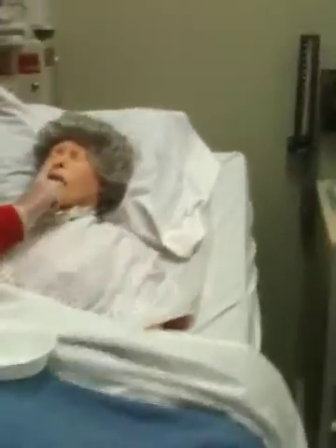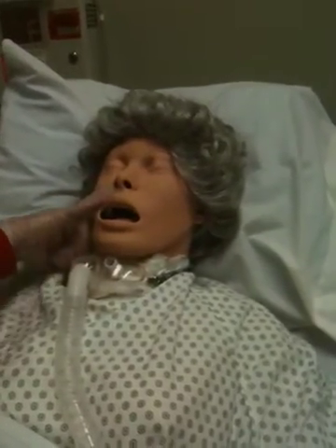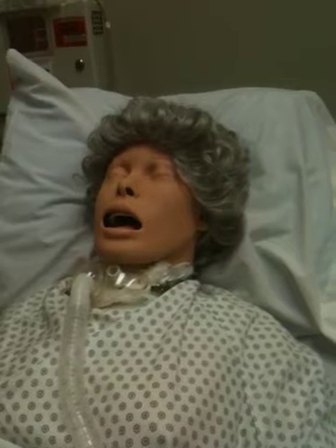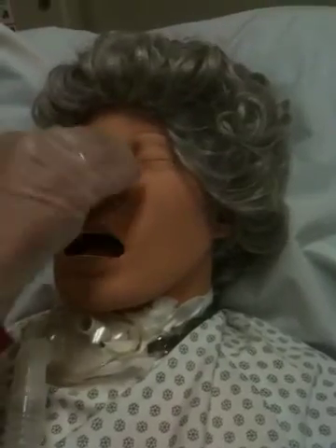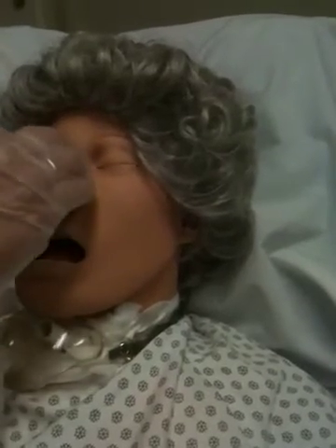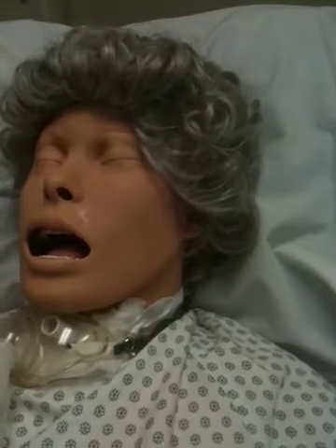I'm going to occlude one nare at a time and have the patient blow. I'll say 'okay, blow out,' then occlude the other nare. It feels like the left side has more air, so I'm going to use that nare to insert the NG tube. I'm going to clean the bridge of the patient's nose with alcohol to remove the oil and help the tape or NG secure device stick better, and allow that to dry.